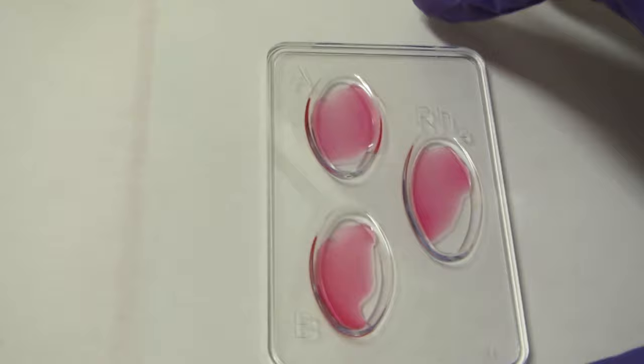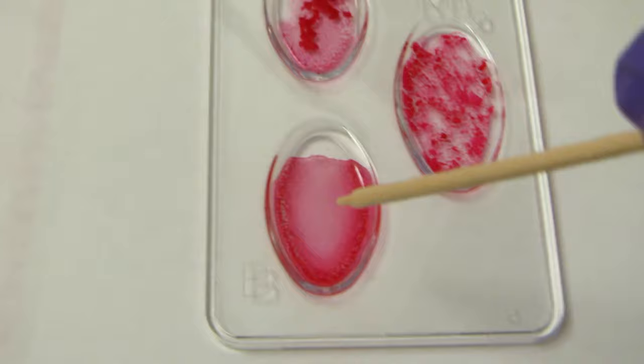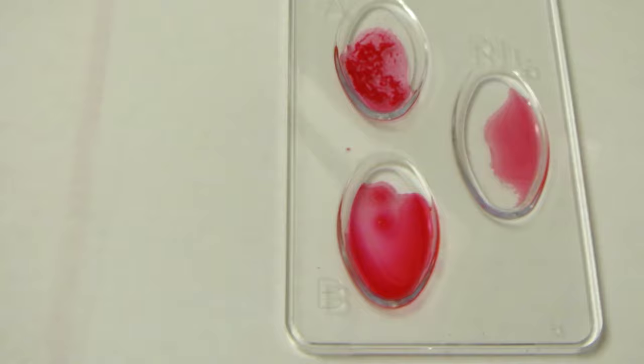Now let's take a look at the different blood types and what results you get. Here's our first one: we've got obvious agglutination — i.e., clumping — in the A well, nothing going on in the B well, and obvious agglutination or clumping in the RH well. So this blood sample is A positive.